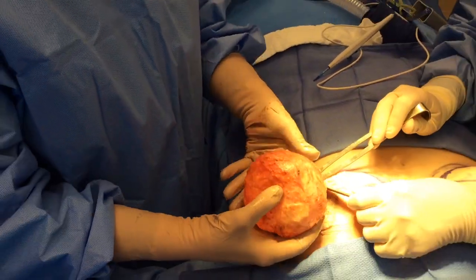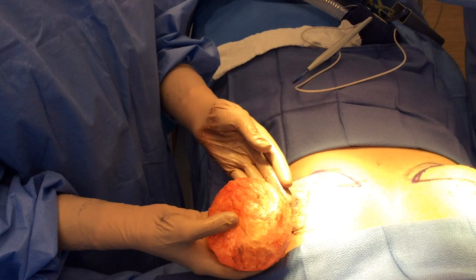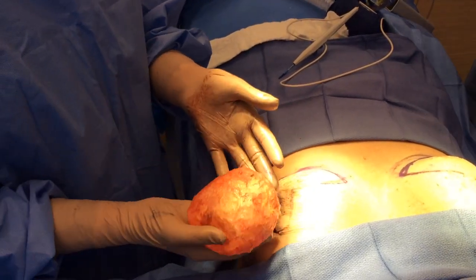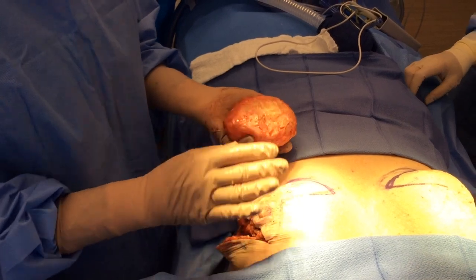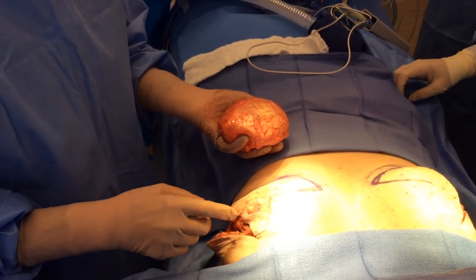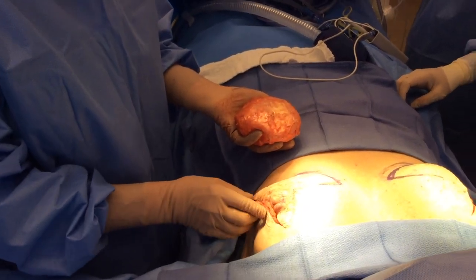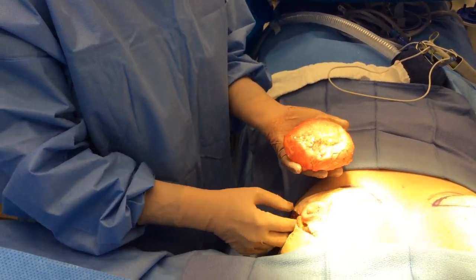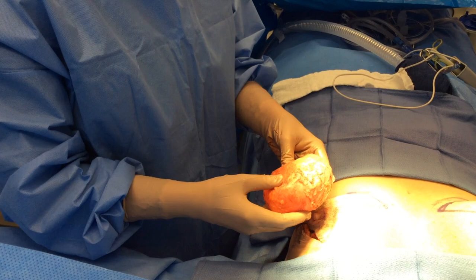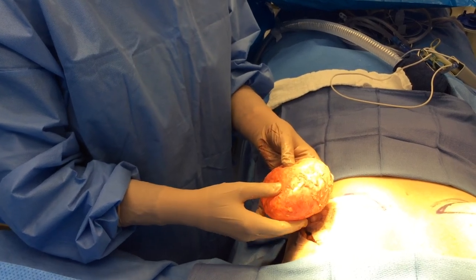We have the implant removed completely en-bloc. Soon enough I'll come back to this, make sure she's nice and dry, put a drain in, and do her breast lift and hopefully get her restored to a place that she feels really good about. More importantly, hopefully she's going to feel much better with having these implants out.